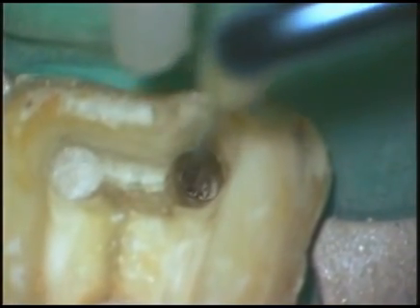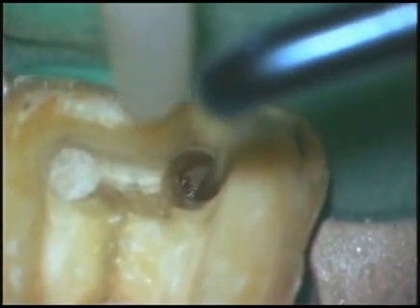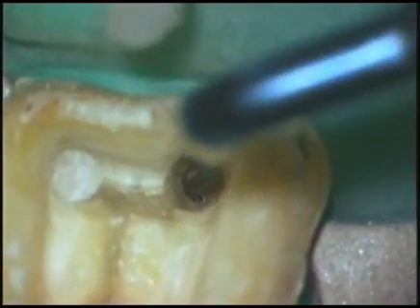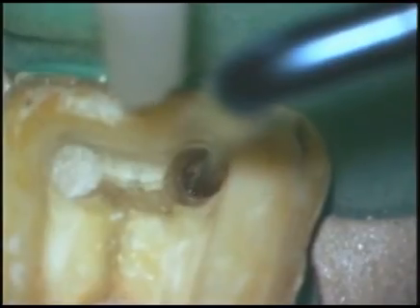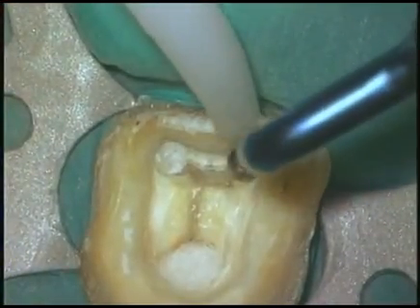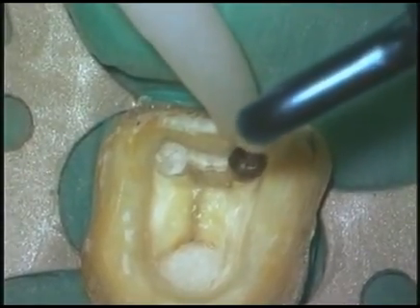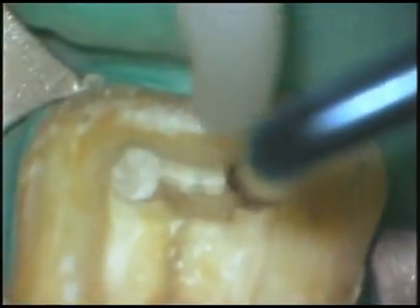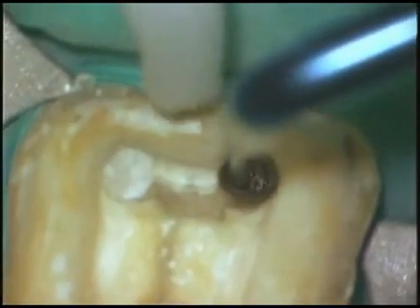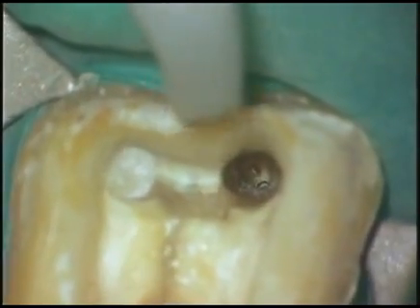Clearly, we're going to need the small profile of a titanium instrument. We need to be very mindful of external root anatomy. In this case, we don't take the ultrasonic instrument circumferentially around the fragment because that would weaken the tooth or predispose to strip perforation. As we vibrate just basically directly on the head of the broken instrument, sometimes this will loosen it and it'll kick the instrument up and we miss its departure.